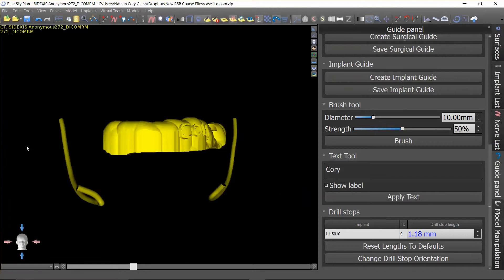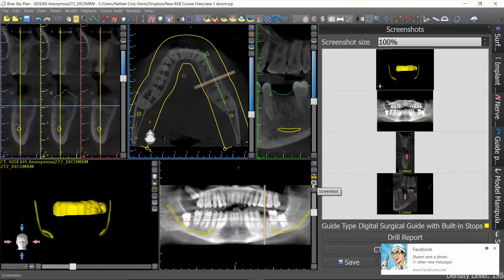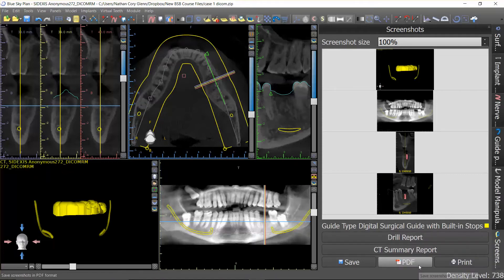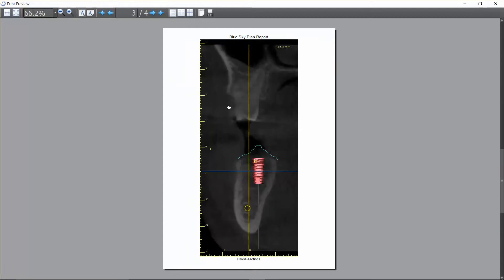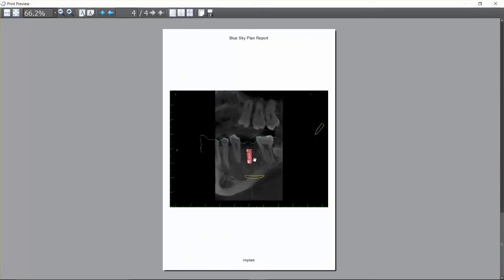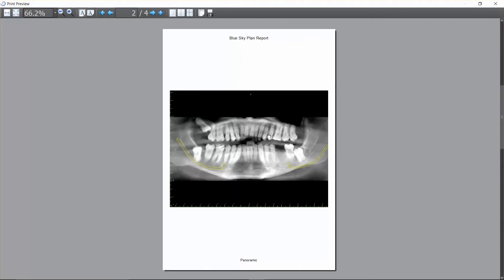The other thing you might want to do is run a drill report — go to file and run a drill report. This shows multiple auto-generated screenshots. This button, available in all windows, will capture screenshots, so if you saw something you wanted to capture you can push it and it will add that to the drill report. Push to generate a PDF of the drill report — I print these out and tape them up behind the patient. It's nice to have at a glance all the information: the nerve, implant positioning, and all surgical references, so I don't have to navigate through the software during the procedure.